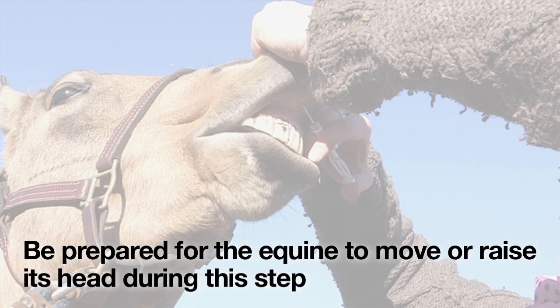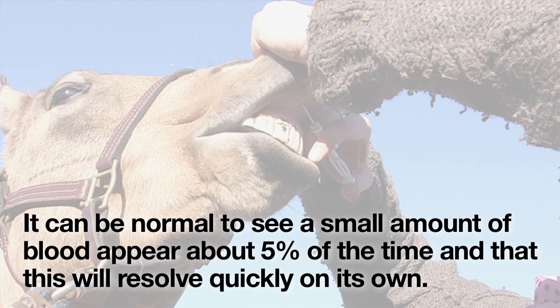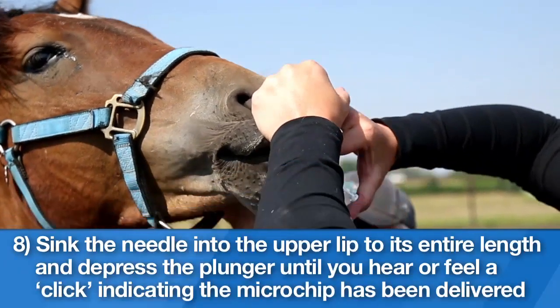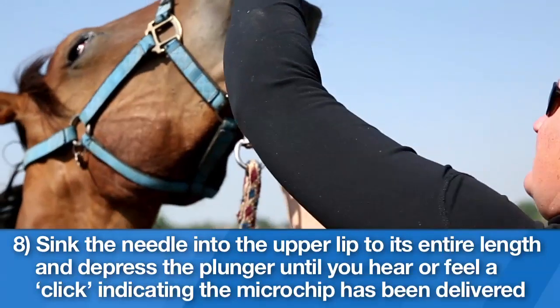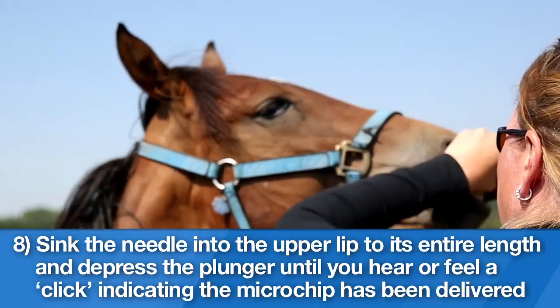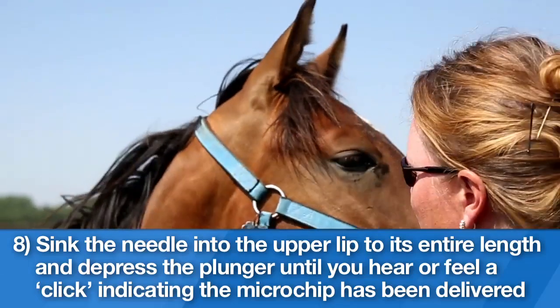Be prepared for the equine to move or raise its head during this step. It can be normal to see a small amount of blood appear about 5% of the time, and this will resolve quickly on its own. 8. Sink the needle into the upper lip to its entire length and depress the plunger until you hear or feel a click, indicating the microchip has been delivered. Remove the needle.